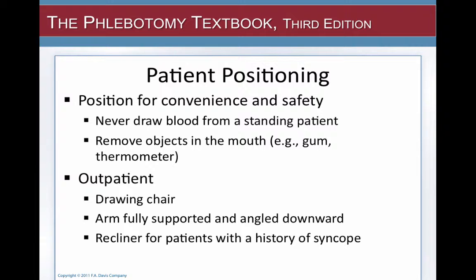If they're outpatient, most outpatient facilities have a drawing chair. Make sure their arm is fully supported and angled downward and is comfortable for both them and you. And if they are known to have a history of fainting, make sure they're in a reclining position.